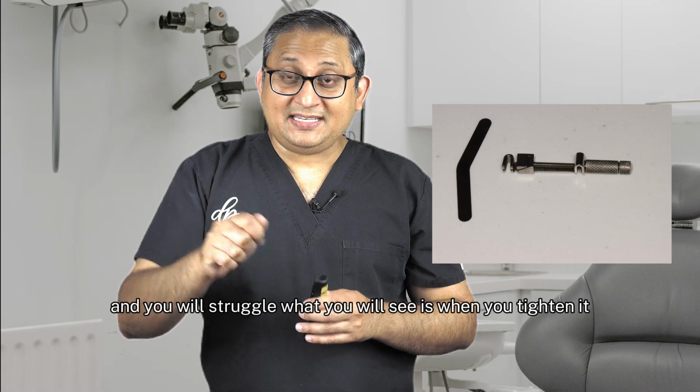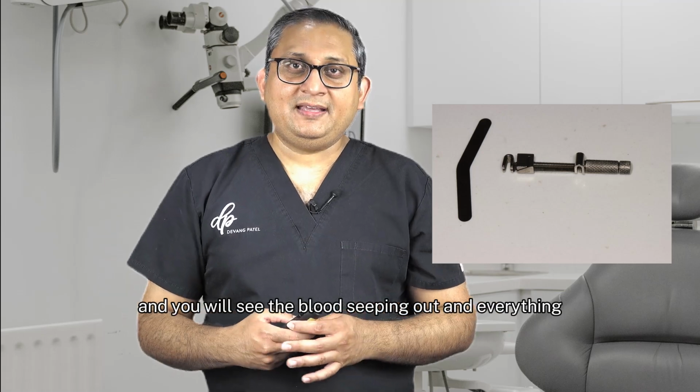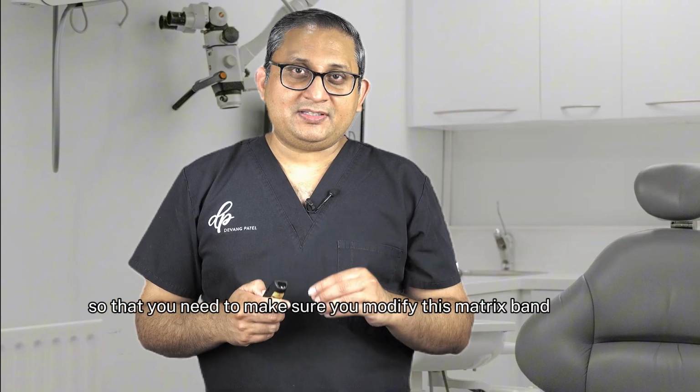What you will see is when you tighten it, you start getting a gap appearing at the base of the box, and you will see the blood seeping out and everything. And so you need to make sure you modify this matrix band system.